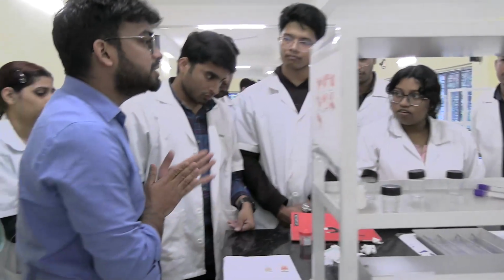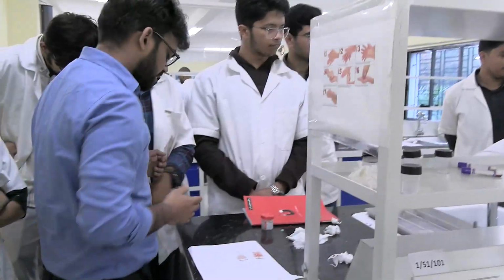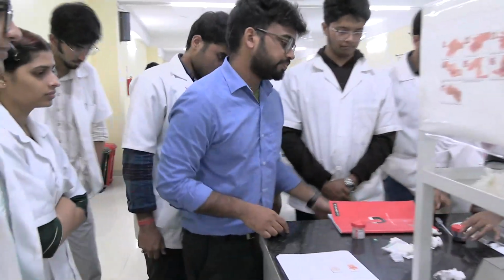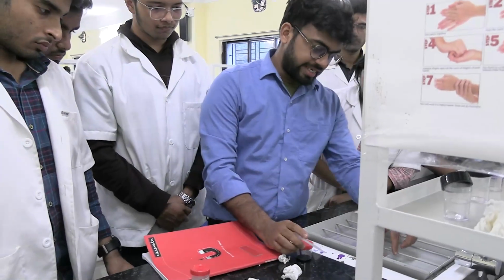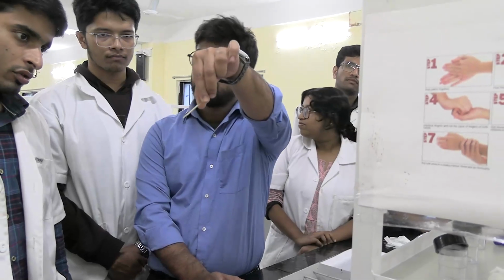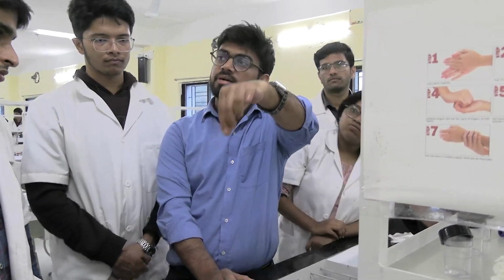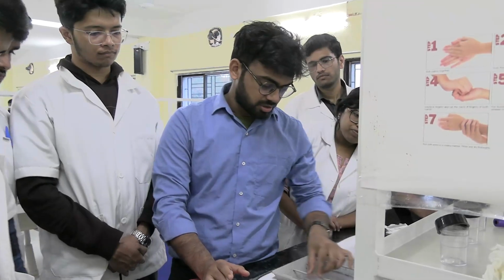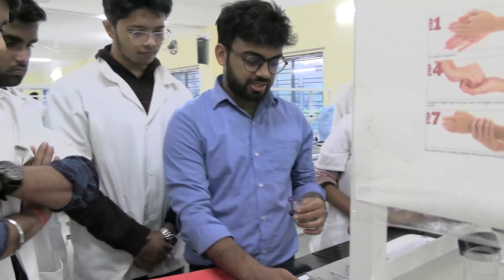Add what? Leishman stain. Bring me the Leishman stain. It has dried completely now. Are you sure? Make sure it is dry, by air dry. Suppose I place it here. Now, this is Leishman stain, right?